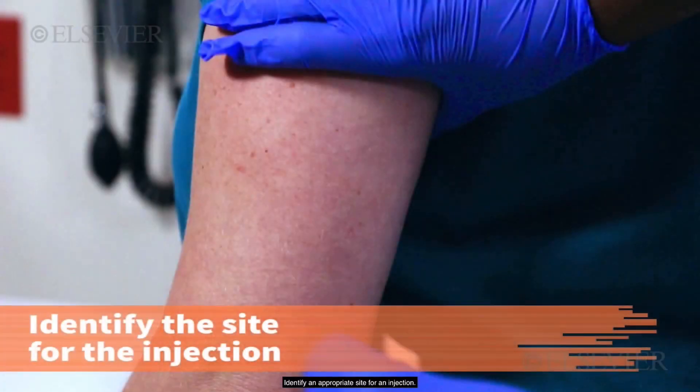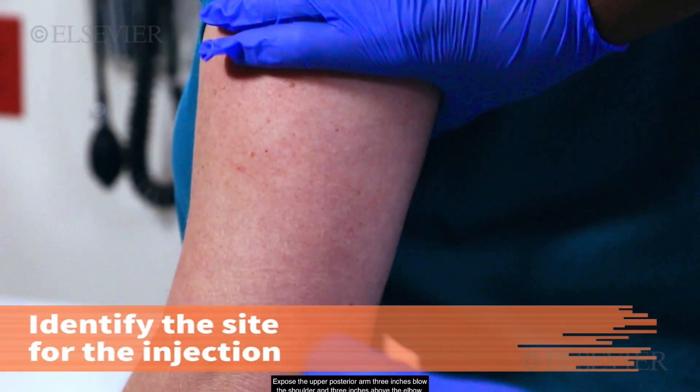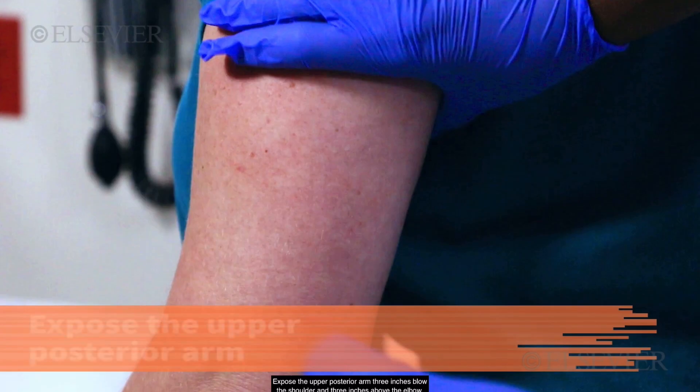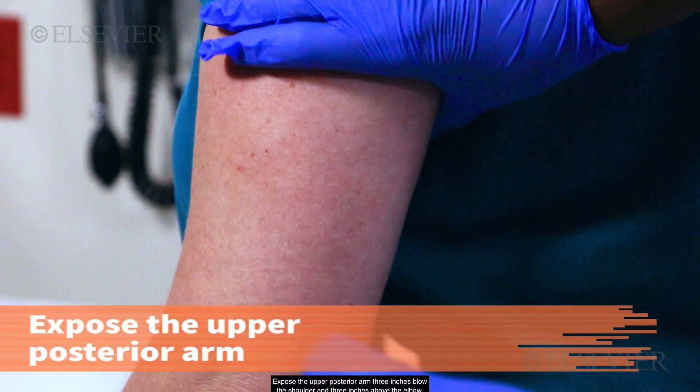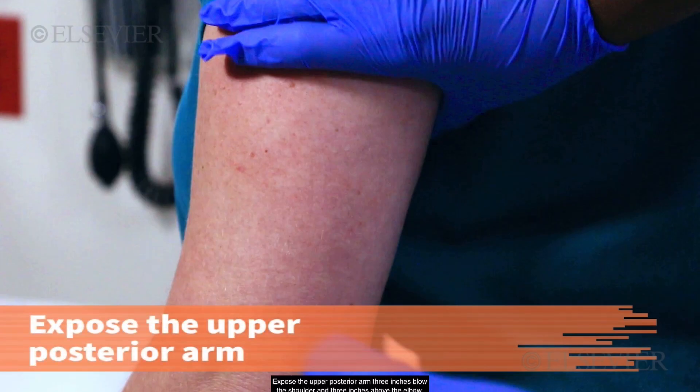Identify an appropriate site for an injection. Expose the upper posterior arm, 3 inches below the shoulder and 3 inches above the elbow.